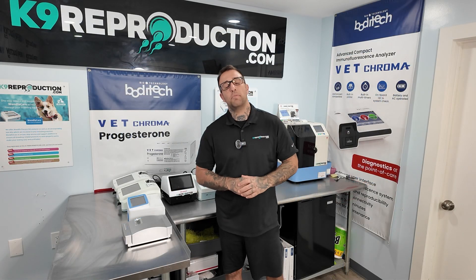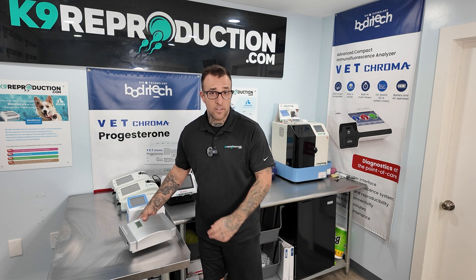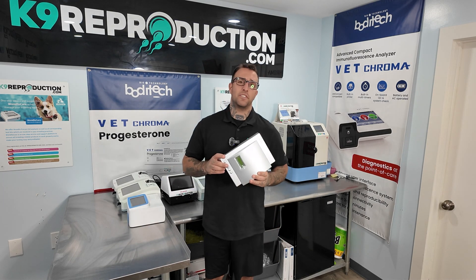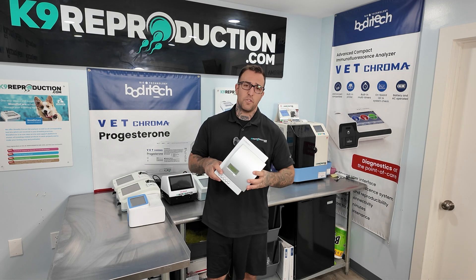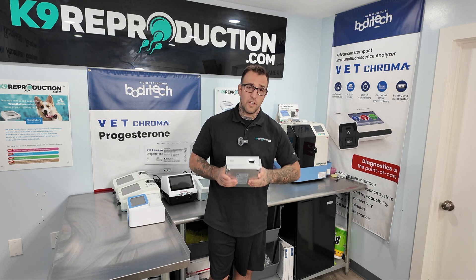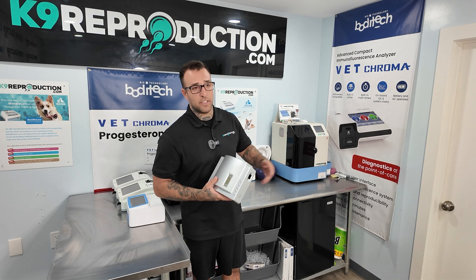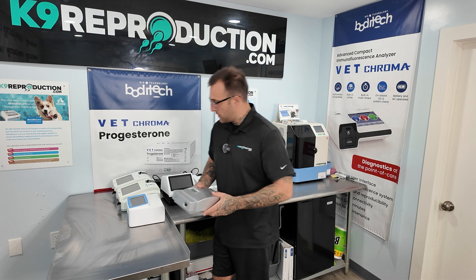Now let's talk about some machines you should definitely not be buying. While the iChroma 1 was a great machine in its time, I would definitely not be purchasing these on the used market because they don't make test kits for them anymore, and even if you can find test kits, they're simply not going to be that accurate. If you're using one, think about using our trade-in program and getting into a Vet Chroma instead, which is calibrated and quality controlled for dog blood — the iChroma was originally meant for humans.